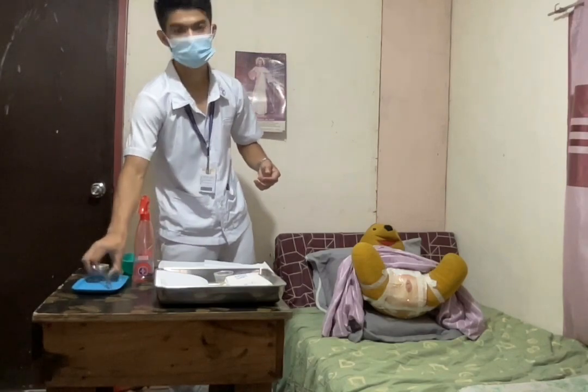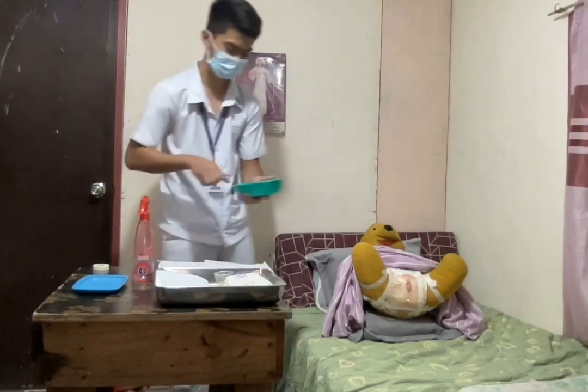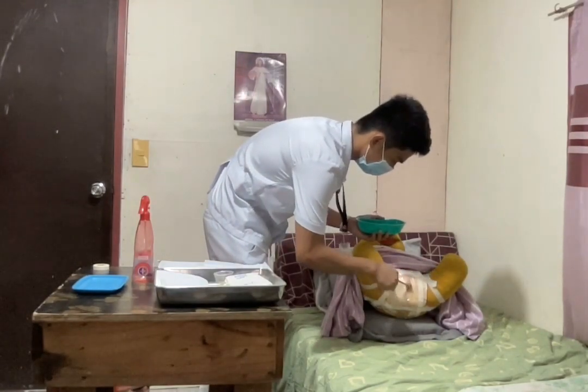Next, using the sterile forceps, I'm going to cleanse the area using cotton ball with betadine. This is to prepare the procedure site by disinfecting the area. Now I'm going to sanitize your area.